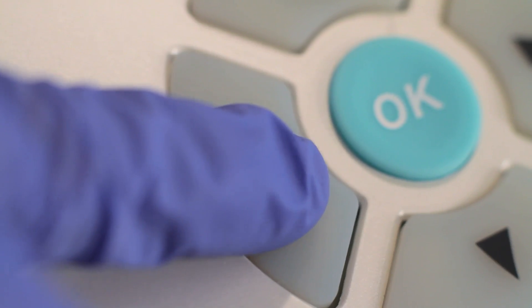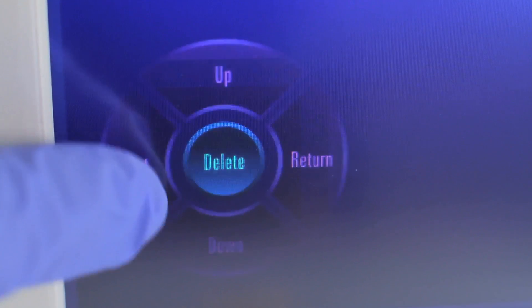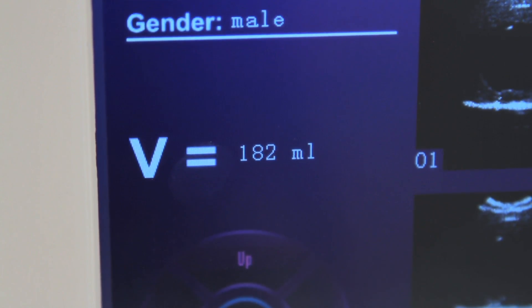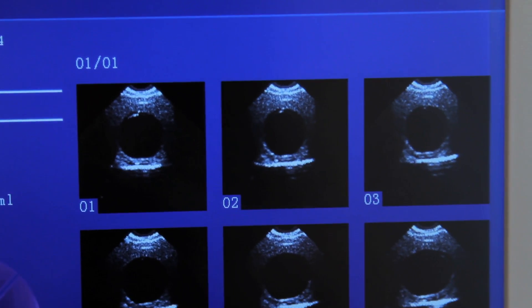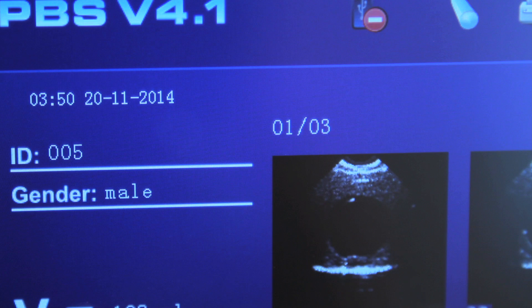To browse historical records, press the left directional key or touch the Browse functional key to enter the Browse Historical Records screen. The screen will display the patient's ID, sex, and measured volume record. Images from past scans will be displayed on the right under the patient ID, with six images displayed per screen. For example, if '1/3' is displayed, it means this is one of three total records that have been stored.